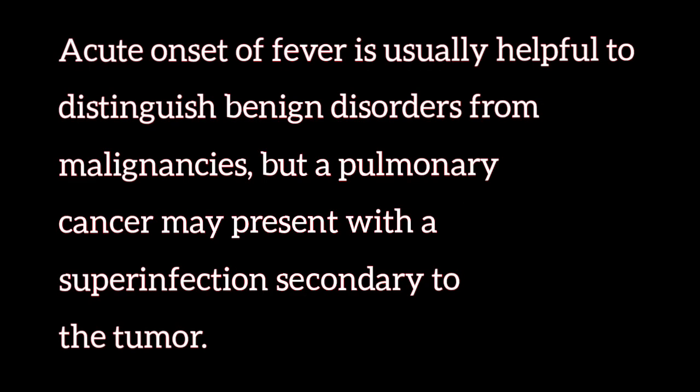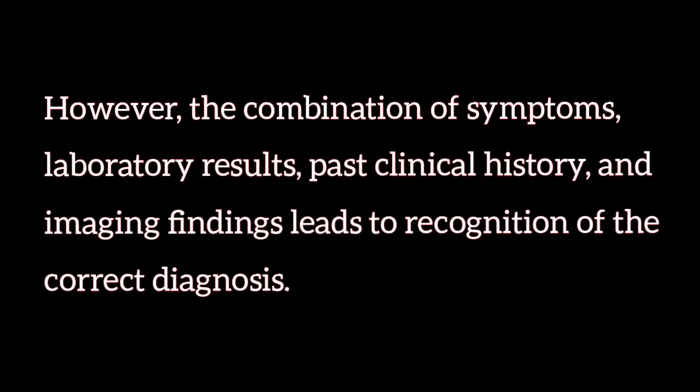Acute onset of fever is usually helpful to distinguish benign disorders from malignancies, but a pulmonary cancer may present with a superinfection secondary to the tumor. However, the combination of symptoms, laboratory results, past clinical history, and imaging findings leads to recognition of the correct diagnosis.